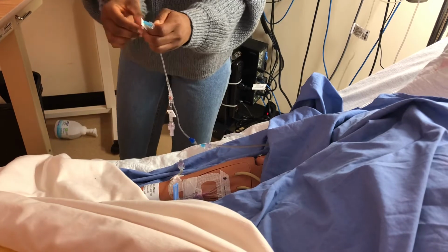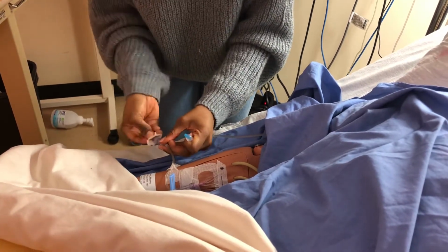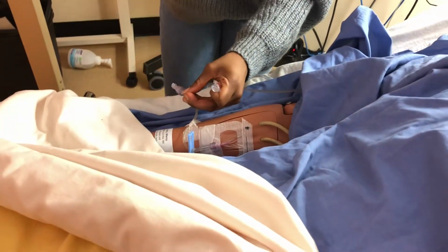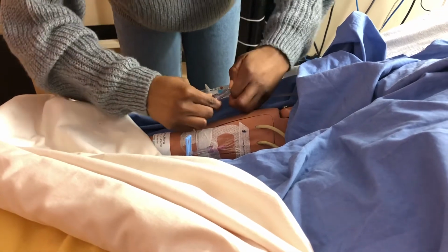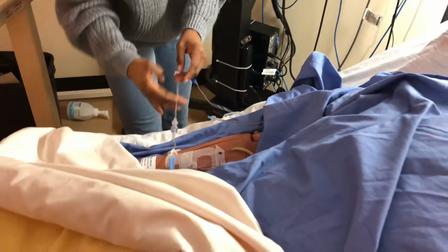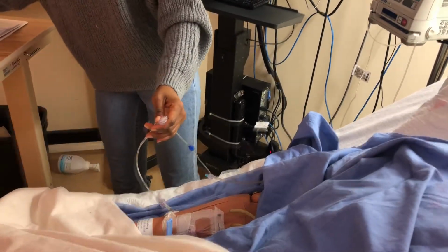Losing this a little bit, okay? So now I will attach this here. Clean for 30 seconds, leave to dry for 15. Take this off, and now I can directly attach. So after I've attached, then I will alcohol swab this part. Again, take another alcohol swab.